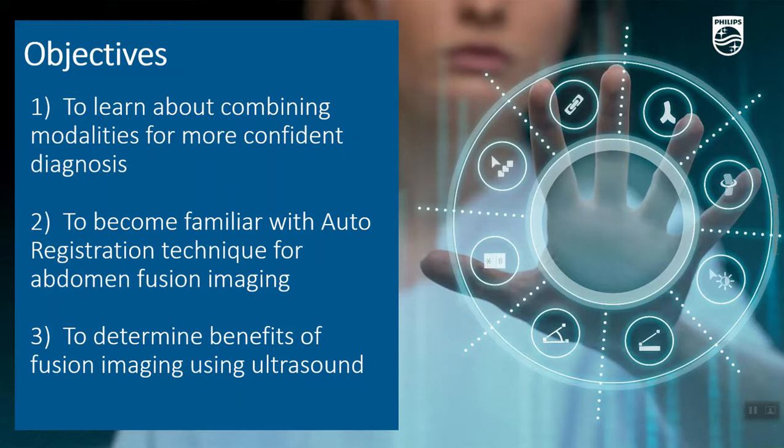This presentation will give you an overview of Philips auto-registration technique that brings new levels of simplicity to abdomen image fusion. And then we will see the benefits of fusion imaging using ultrasound.